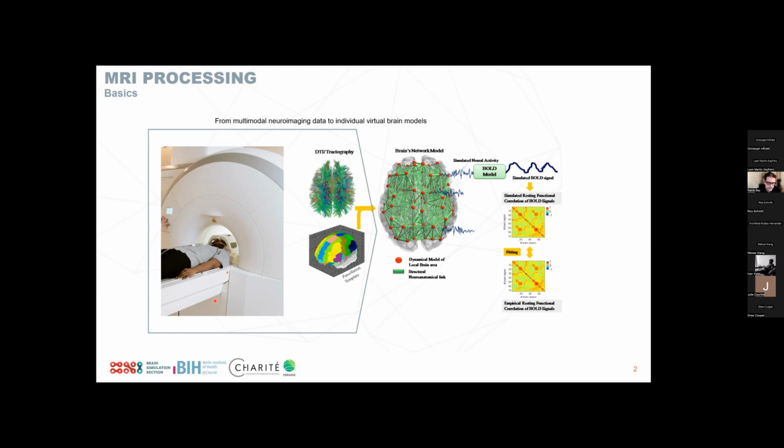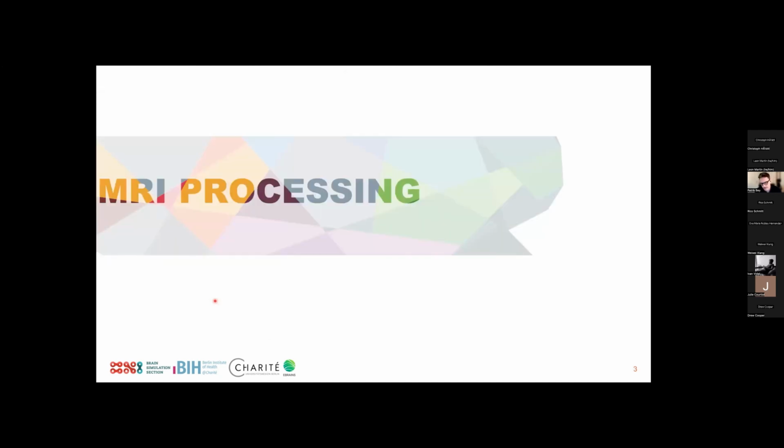This is what we're going to try to answer today, in particular if that happened to be a stroke patient, which is just a stock image. I don't think that's the case, luckily. So the first chapter, like I said, is going to be just general MRI processing. I'm not going to go too deep into detail on anything, because MRI processing is a lifetime's work anyway. So if you have any more questions about some details or anything, please feel free to ask them right away or at the end. Like I said, I'm open to both.